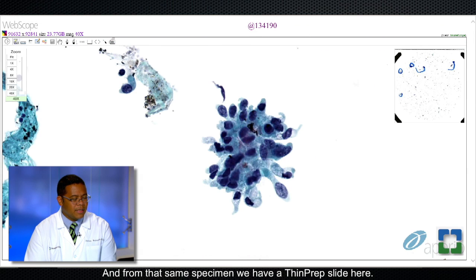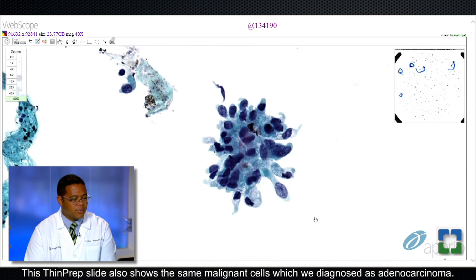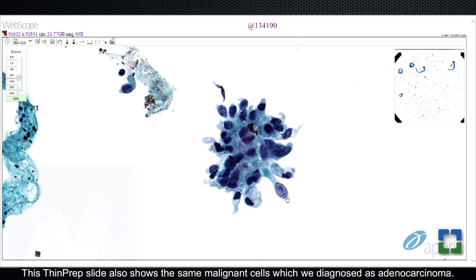From that same specimen, we have a thin prep slide here. This thin prep slide also shows the same malignant cells, which we diagnosed as adenocarcinoma. With the cell block specimen, we were able to perform immunohistochemistry stains of TTF1 and Napsin, which were positive. That confirmed our diagnosis of adenocarcinoma.